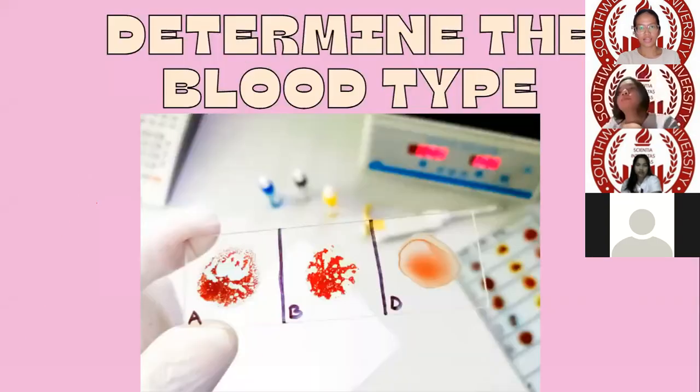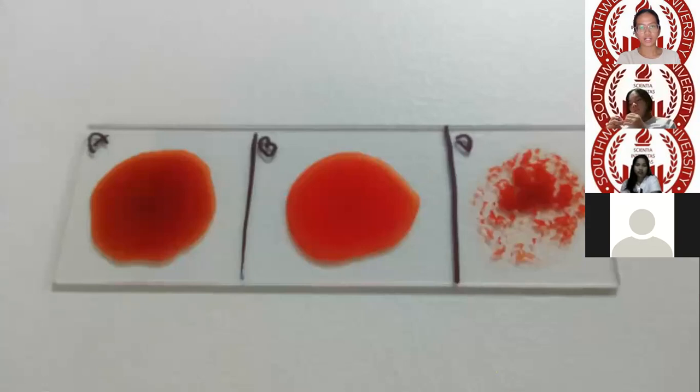So the first one is, can anyone answer what the blood type is for this slide? 5, 4, 3, 2, 1. Since there is no clumping in both the anti-A and anti-B, this is O positive. With the anti-D, we can see some agglutination.